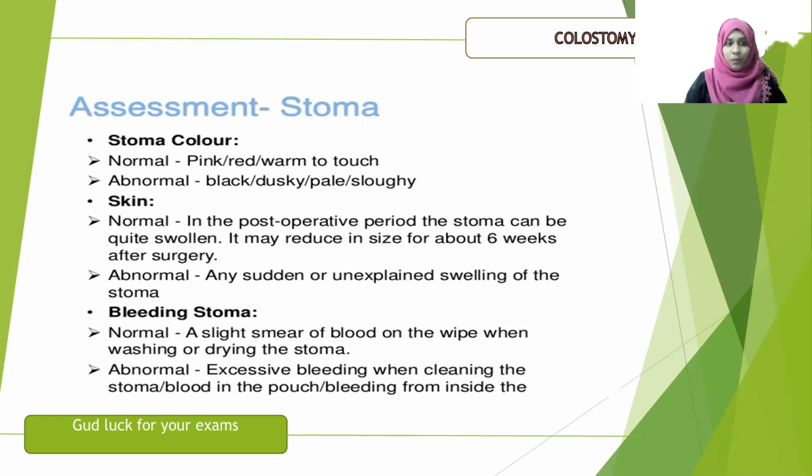Next is bleeding from the stoma. Immediately after the surgery, there will be a certain amount of bleeding. We can assess if there is excessive bleeding during the cleaning, or excessive blood in the pouch, that indicates abnormality.